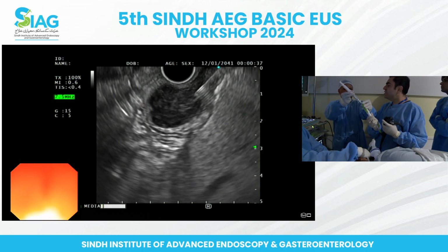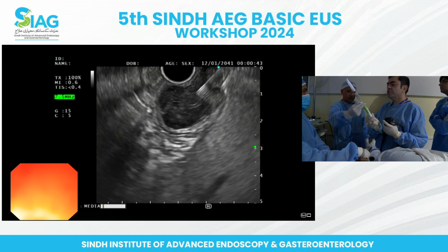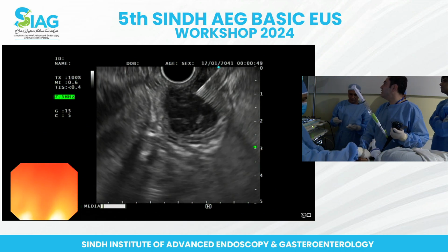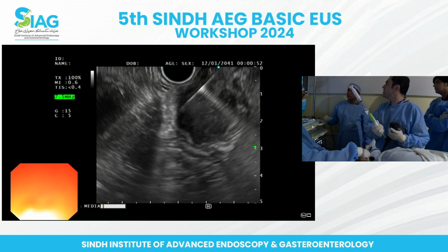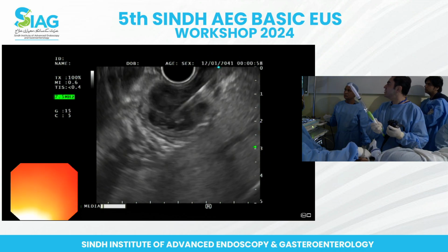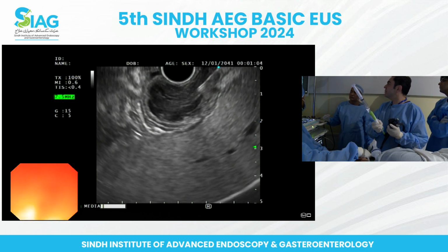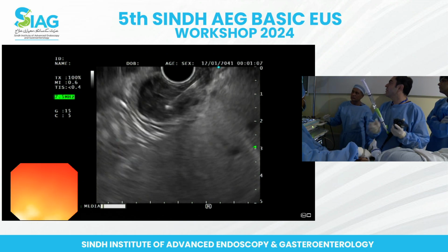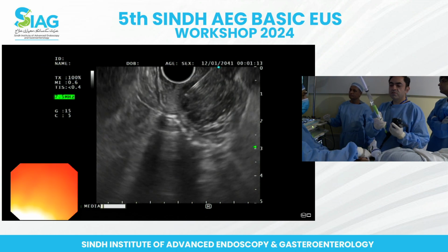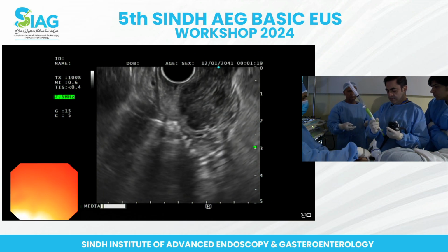Was there any sort of material, or nothing came out? No, nothing there. So we're going to try again. This, it seems very soft as well. Yeah, just hold it. So I'll just do some fanning of it if I can. So that we can get some variety of the sample in different areas. So seem to have sampled quite a bit. I'll just take it out. Fingers crossed. Let's hope.